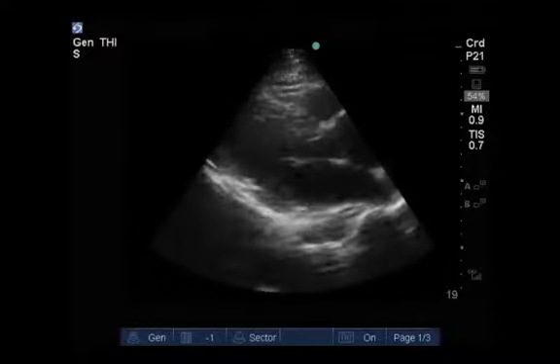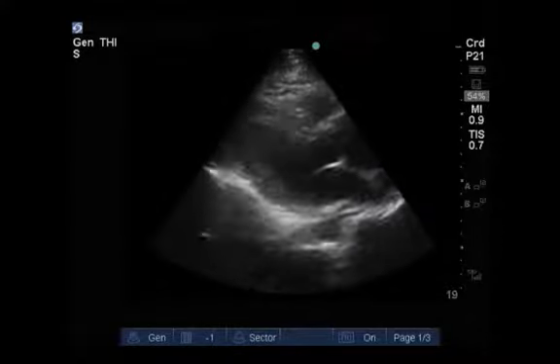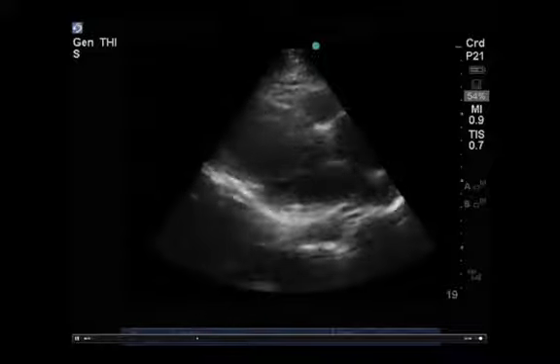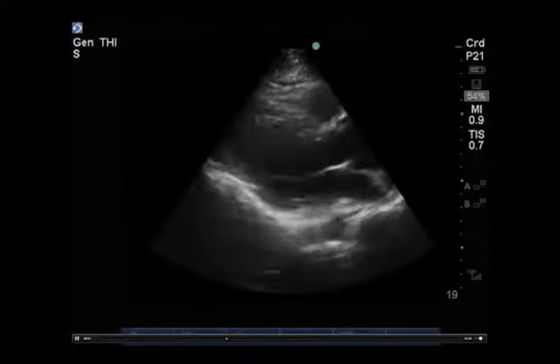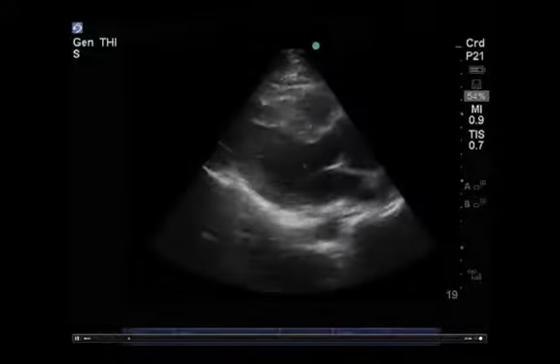Lastly, here is another parasternal long axis view, and I want to turn your attention to a more subtle finding where we see here the aortic valve looks reasonably normal, though the aorta itself looks a bit dilated. And we see the mitral valve here, which actually opens pretty freely. But of note, during diastole, we can see the anterior leaflet.